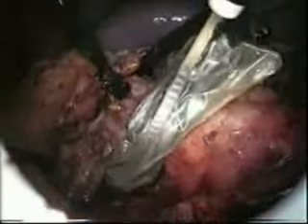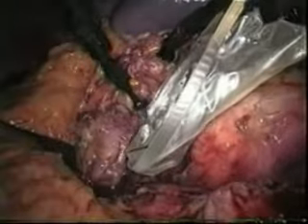Finally, the adrenal gland is maneuvered into the endocatch bag and extracted through the supraumbilical camera port incision.